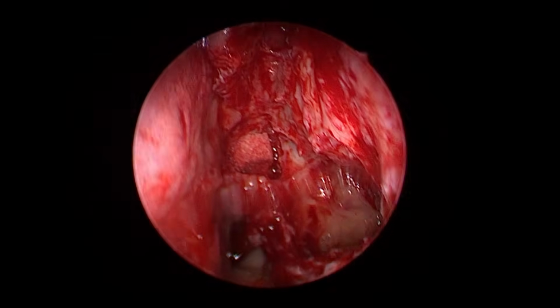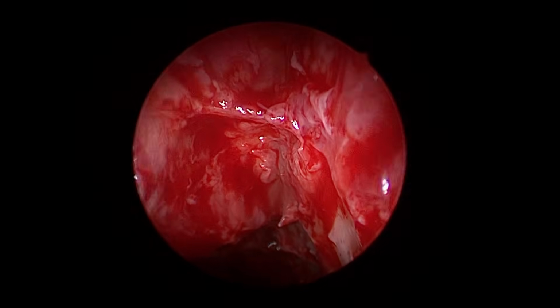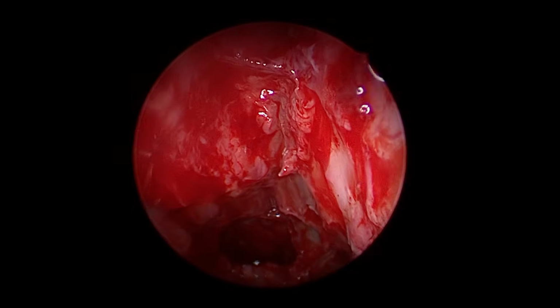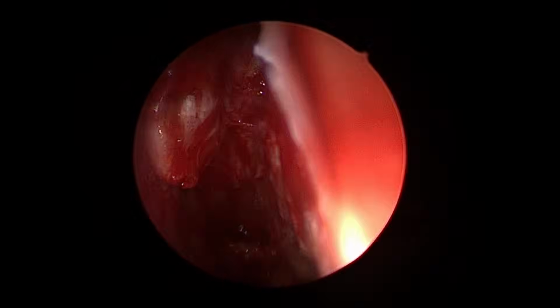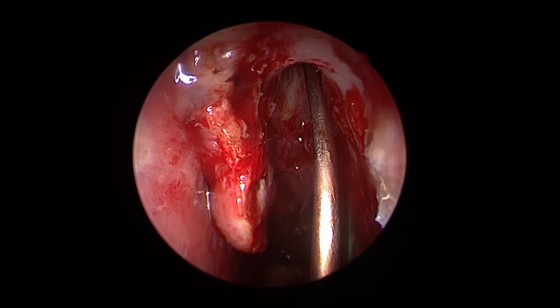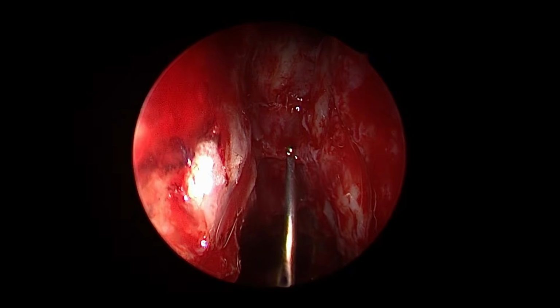Dr. Satish, at this level, where will be the anterior ethmoid arteries? Ethmoidal artery is here. This prominence. I am not disturbed because it is not prominent. Here it is. And see, while working at the beak, we were working in this direction. And ethmoid artery is a posterior wall in this direction.